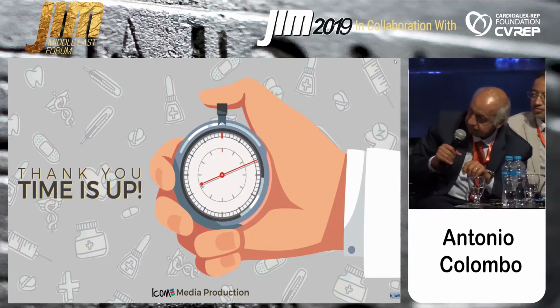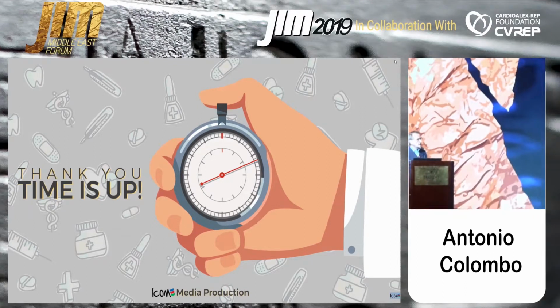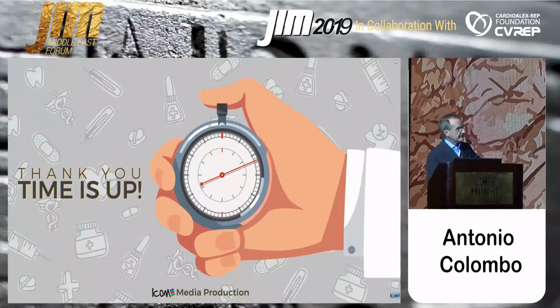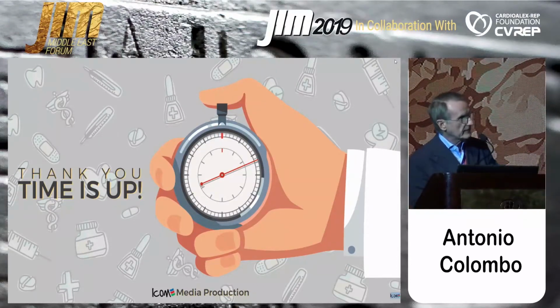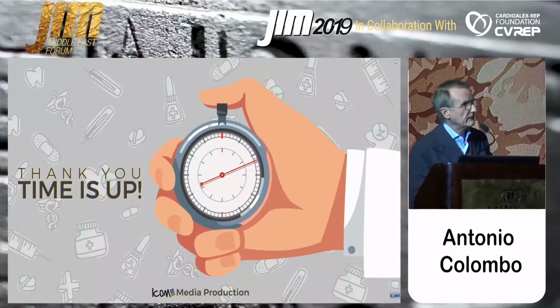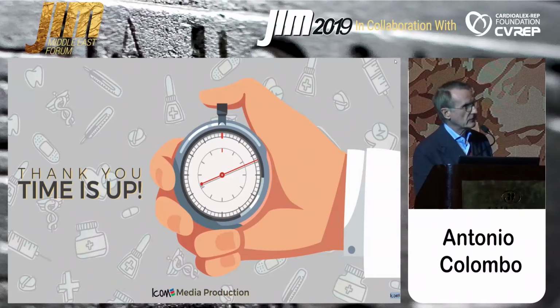No, I think it's okay. I'm not very enthusiastic about doing crossover left main to circumflex unless the LAD is really in good shape, because I'm always afraid for the LAD. But if I do that and I do FFR and the FFR is 0.9, it has to be really good, I think it's fine. But I think if I don't do FFR, IVUS or have a very excellent angiographic result... Okay, thank you very much, Antonio.